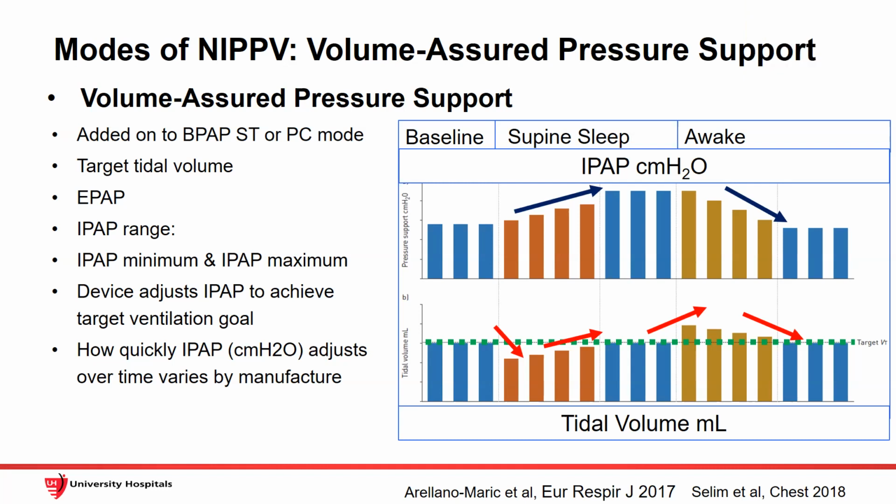What's the other adverse effect of too much pressure? What kind of disordered breathing could excessive IPAP cause? Breath stacking?